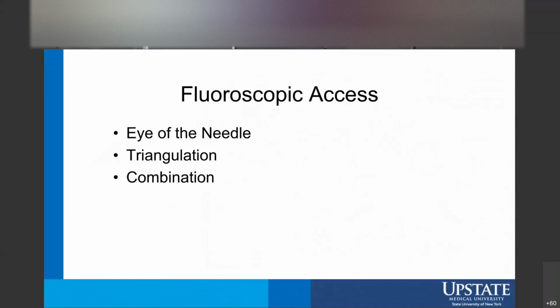So there's 3 main techniques to do fluoroscopic guided PCNL access. We can do eye of the needle, we can do triangulation, or we can do a combination of techniques, which we'll call pseudo-triangulation.